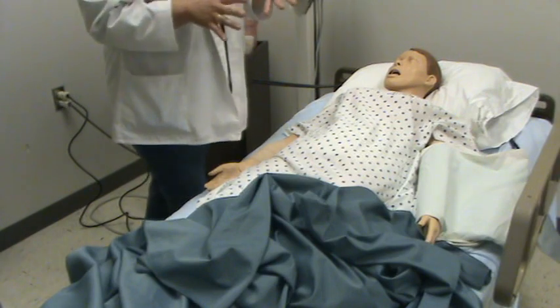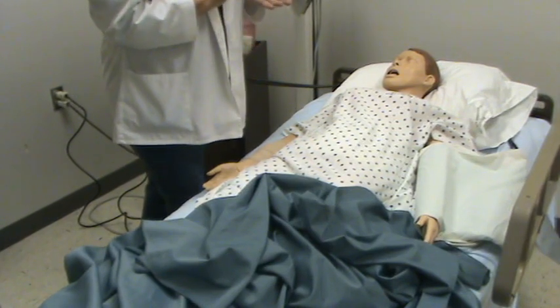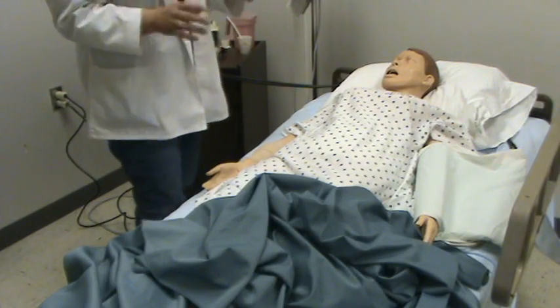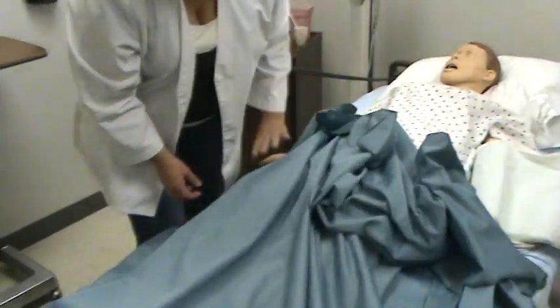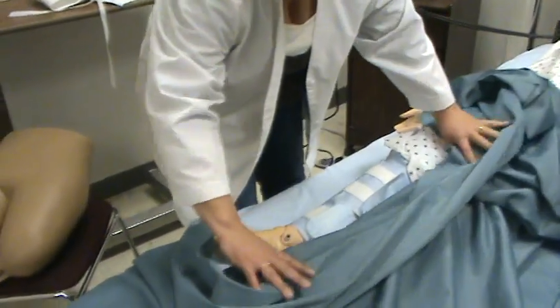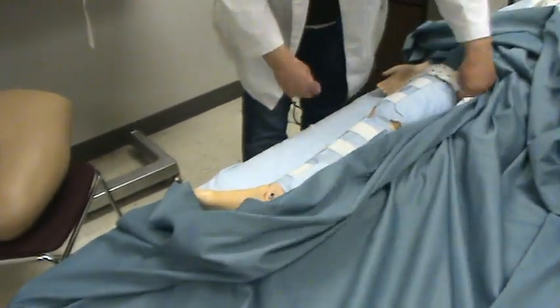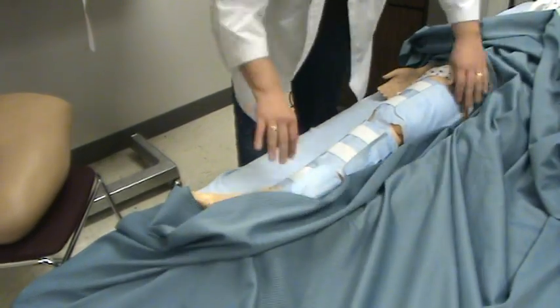Your Mosby's reference goes into hot and cold and has a lot of good information on all of this. The last thing to cover is your SCDs - sequential compression devices. You see these a lot on post-operative floors.